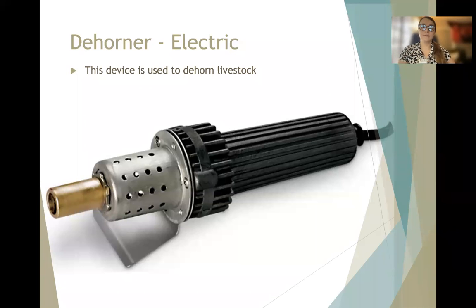We don't usually sedate for dehorning, and it depends on the farm because they are so young. But if done incorrectly, and we've got a patient that is now hemorrhaging and bleeding out, we will definitely have to sedate and cauterize correctly. So it is something that some farmers do on their own, and something they'll also call veterinarians out to do because they don't want that possibility of an emergency situation arising. But we commonly see these electric dehorners, very common, and they're a lot safer.